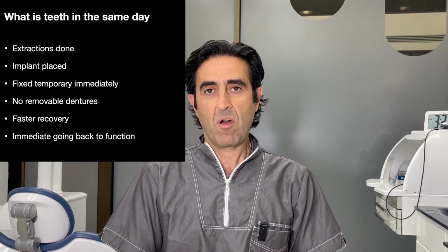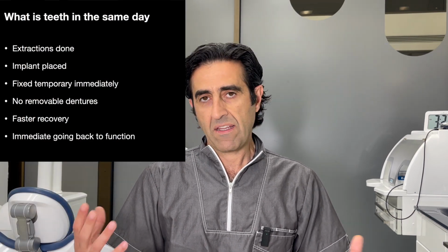But luckily, with the advancements of implants and the digital workflow, we're able to help the patients get from the time when they're going to lose all the teeth to the time that they have a permanent prosthesis in, with minimum interruptions to their lifestyle and with minimum trauma, pain, discomfort, and time in the dental chair. So let me share with you how we do it, and hopefully you'll get the benefit out of my experience.